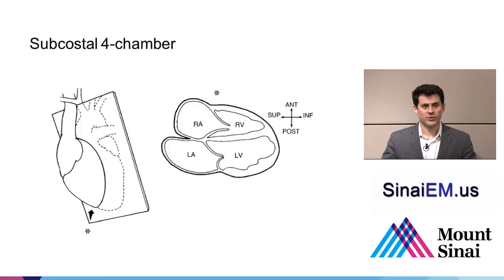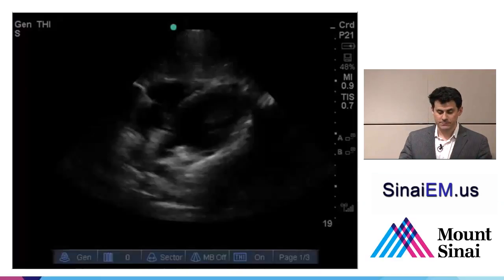If you want to see a good four-chamber view, we should be able to see the apex of the heart, which we can see out here, as well as all four chambers, as well as the tricuspid valve and the mitral valve. So if you're off axis, if you're not in the plane appropriately, you're not going to see all these structures. And it's important to try to get to that same plane, not only to be able to communicate the ultrasound images that you've gotten with people from other departments, so you're getting the same images that cardiology can get, but also because a lot of the mechanics of how you perceive contractility, or the way you look for effusion, or the way you would look for valve function, are really dependent on getting the heart image in a particular plane, and you can get misleading information if you're not in the right plane.